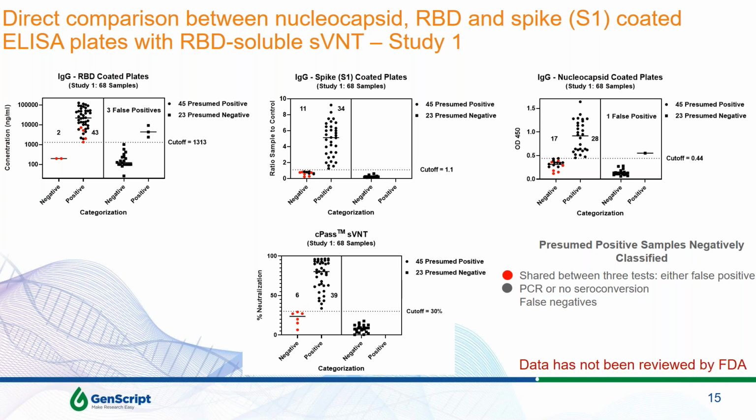And in the article, you'll see that we refer to some papers that question the threshold that's set in qPCR. It's very high in a lot of the qPCR tests used to delineate between negative and positive samples. Some of these tests have cycle thresholds of even 40 to delineate between negative and positive samples, and a cycle threshold of 40 is extremely high. It's way beyond the limit of quantification or detection of a qPCR test.